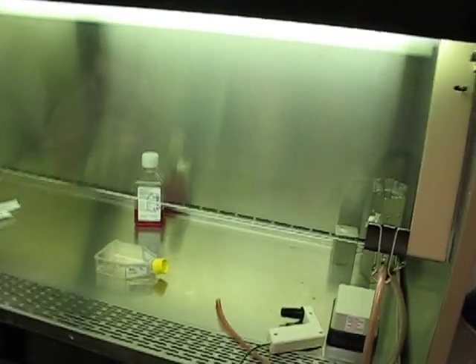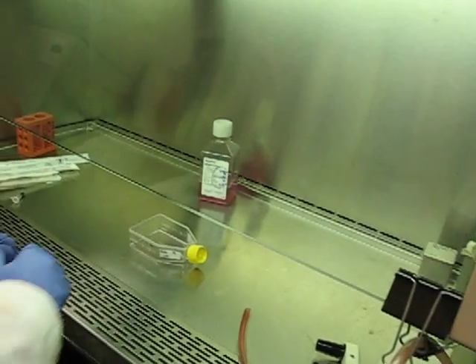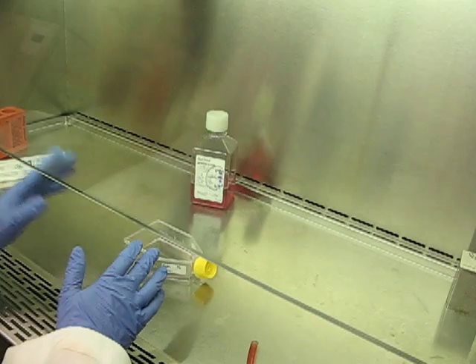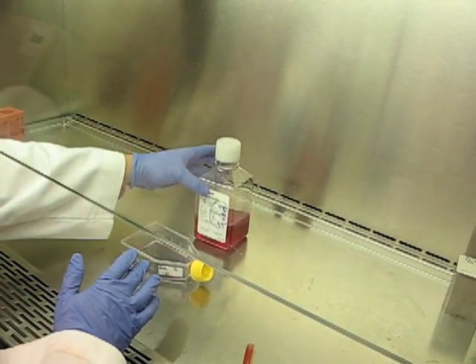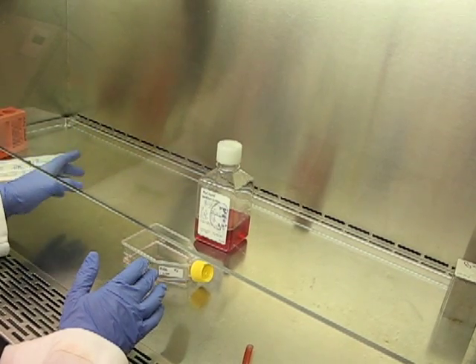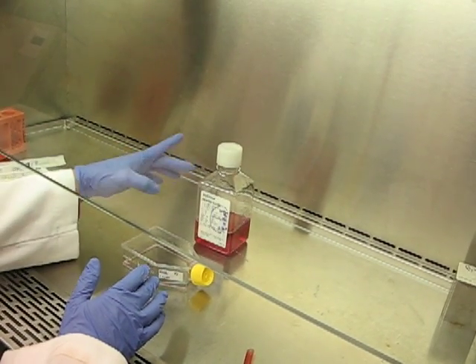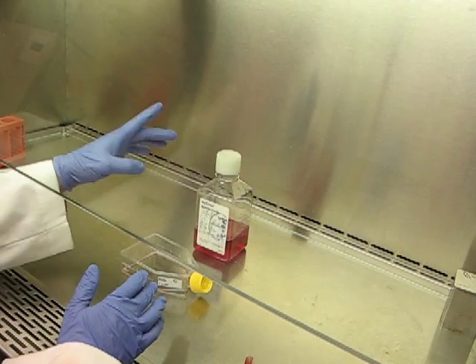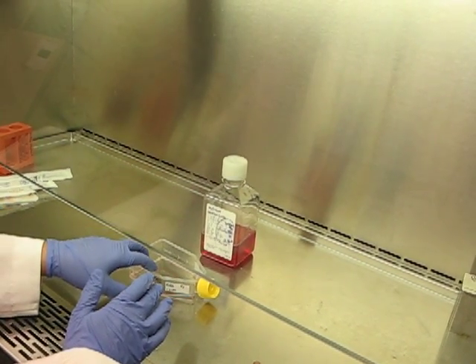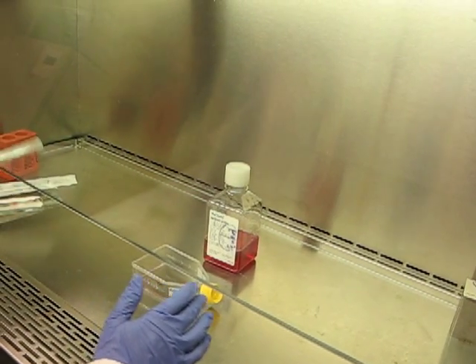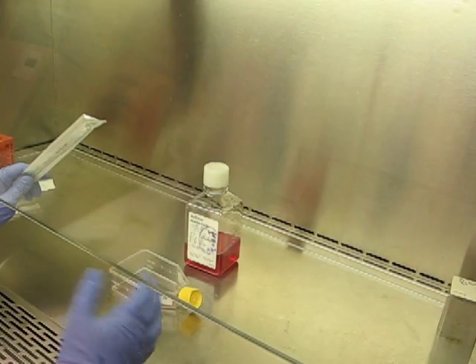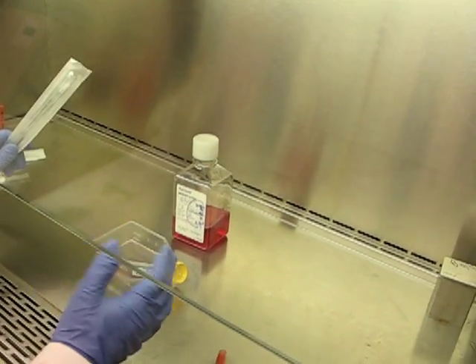Now trypsin, you have to neutralize, and you have to neutralize it with media that contains serum. This media here has FBS in it. You have to use an equal or greater amount of your media to neutralize the trypsin. So we have one and a half mils of trypsin in there.